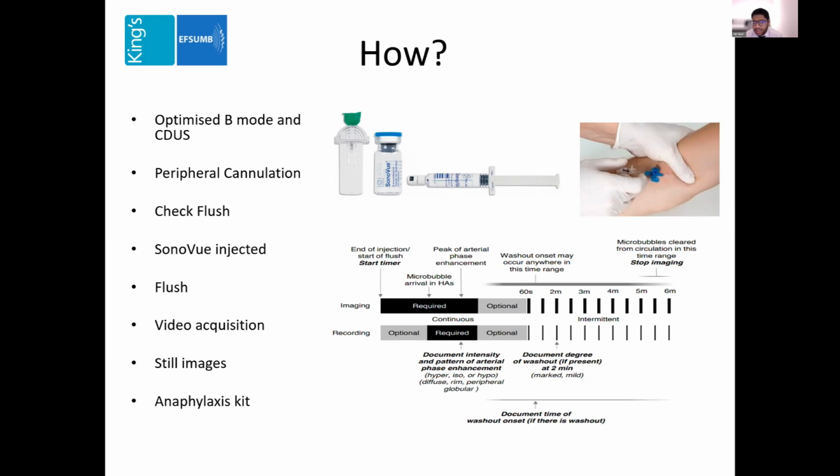As I mentioned earlier, we need a video acquisition, and particularly when we talk about the liver, we need to scan for longer, 5 to 6 minutes usually. But take the video acquisitions because this is your opportunity to go back and look at these examinations.